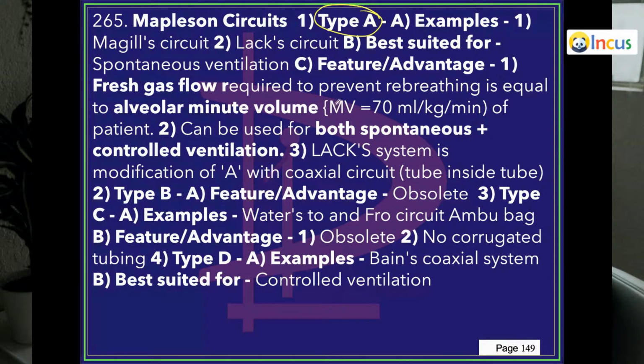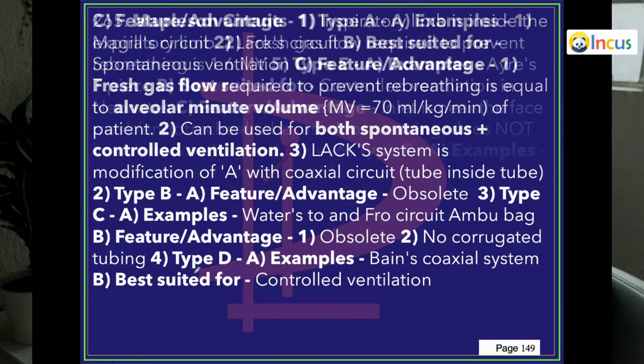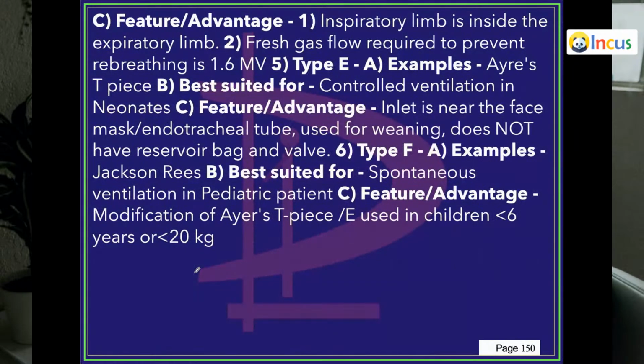Type A, Type B, Type D, Type E and Type F. Let us talk about one or two comments about each of them.